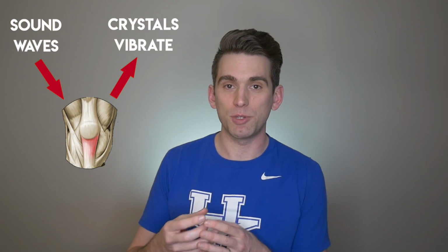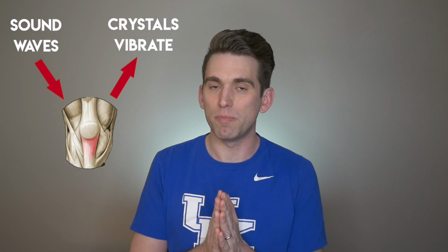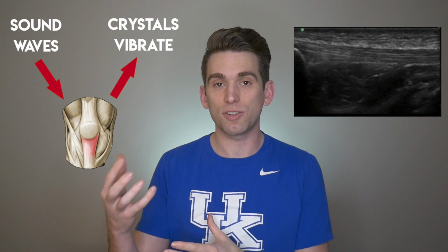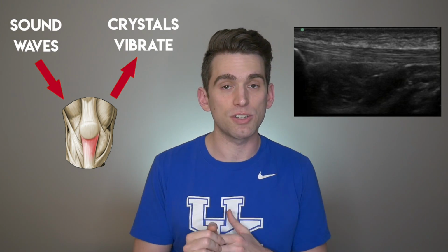The basic physics behind how an ultrasound works is it emits sound waves that reflect off of the tissues and then bounce back up to a crystal that's inside the probe. That crystal vibrates a certain way based on the sound coming back and then generates an electrical signal that gets interpreted as those black and white images you see on the screen.